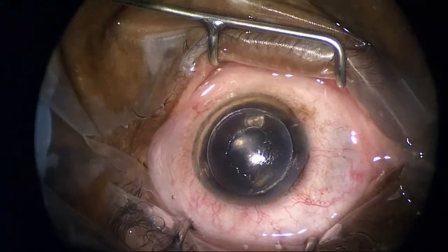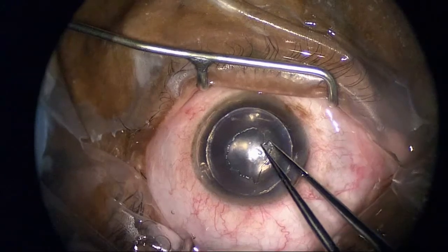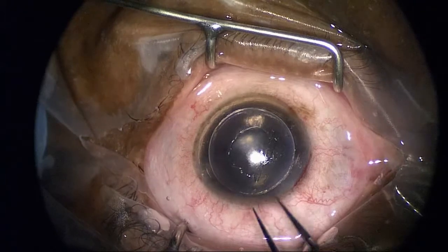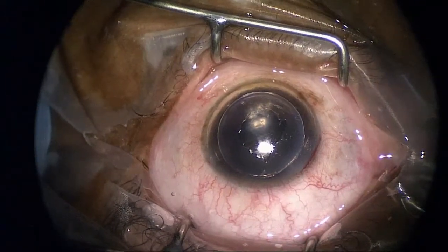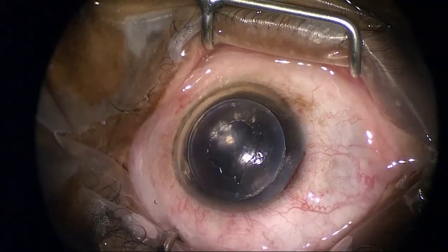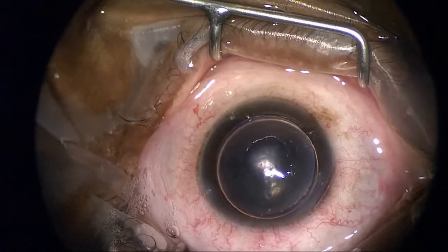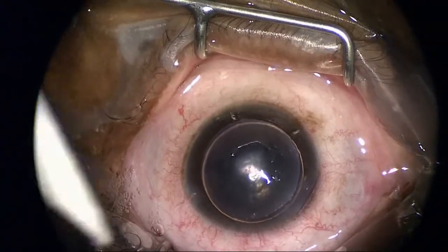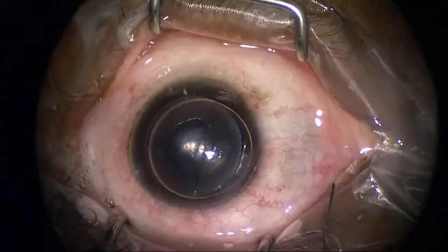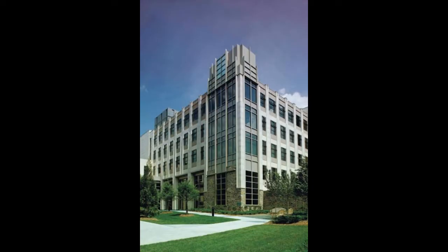Now that I've got all the tissue in and a secure wound, I'm going to remove that loose epithelium. I did this on the first eye and it worked out terrifically, so I have great confidence it will work again here. Had this been a more significant anterior corneal scar, I would have had to do a full-thickness penetrating keratoplasty, but fortunately that wasn't necessary, and this patient has done remarkably well. Thank you.